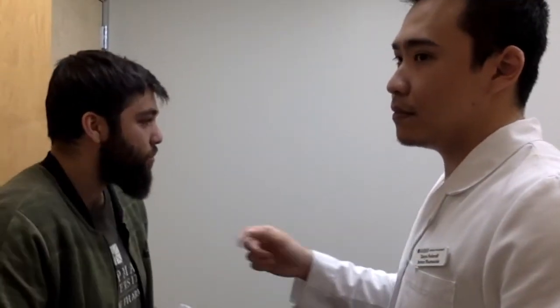Yeah. Thank you for your explanation. I've been using this inhaler incorrectly all this time. For the directions, I've been taking this inhaler first thing in the morning once a day. Is that correct? Yeah, that's correct. It's good that you're taking this inhaler at the same time every day. Adherence is key in treating COPD, so keep taking the medication at the same time every day, but do not take more than 1 dose a day.